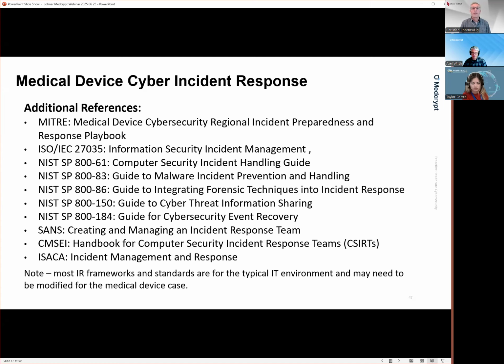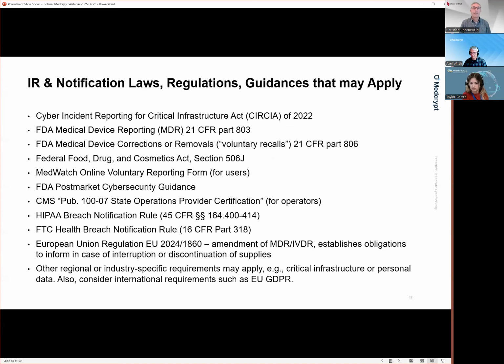Yeah, and not to forget things that are not typically signals from IT security, but that you should consider as proactive data collection, for example, OWASP top 10 threats or vulnerabilities, or competitor information, or technical publications that indicate a change in technology or a change in how threats are perceived. That is also input. So you should create a huge branch of different data sources that you write down in your post-market surveillance plan or cybersecurity management plan.